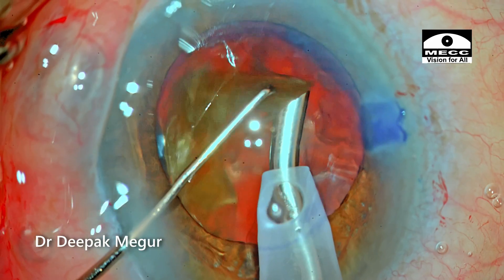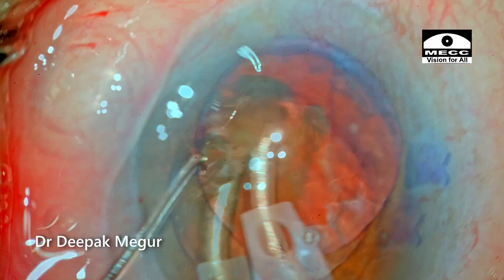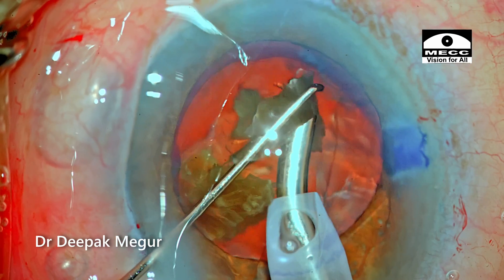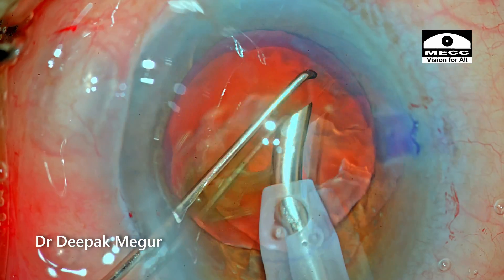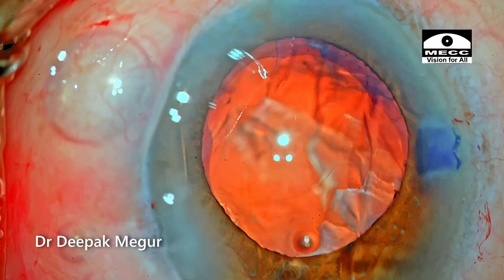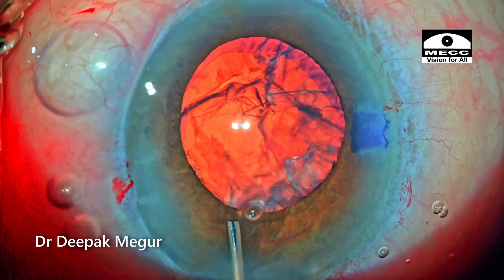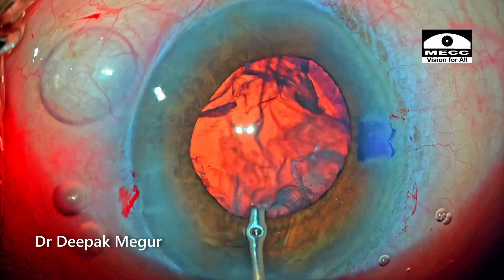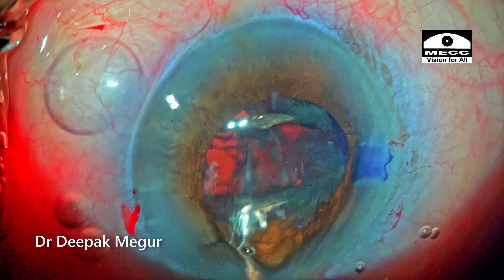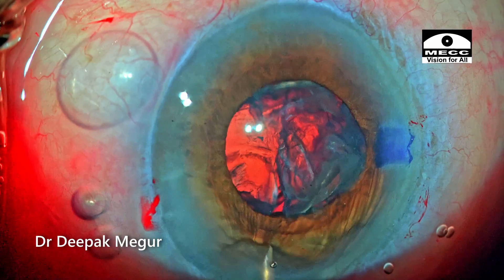By following these two principles, we can ensure the cornea on the first post-op day is very clear and long-term damage to the endothelium is minimal. The epinucleus needs to be removed now — it is sticking onto the posterior capsule. I come out, go in with the BSS cannula, depress the posterior lip, and inject BSS so the epinucleus is maneuvered away from the posterior capsule and folds on its own, making it easier to evacuate.